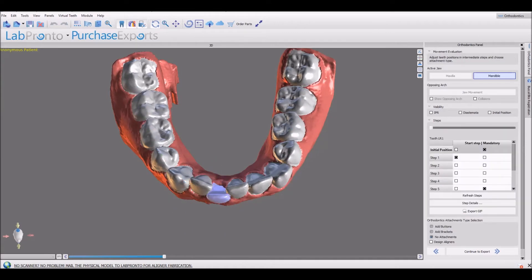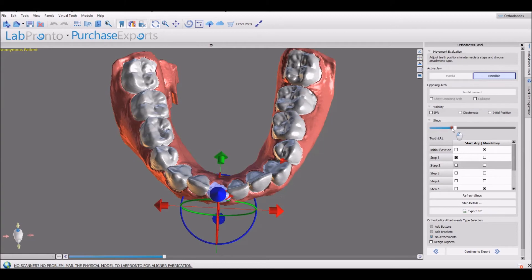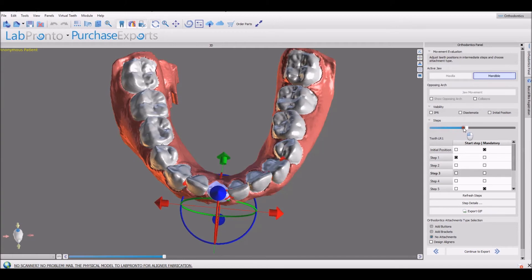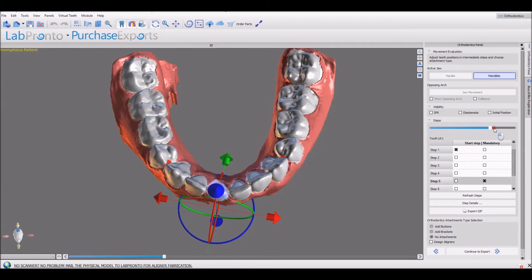We have added an export GIF button to the ortho module to allow the export of a GIF showing the teeth move from model to model, stage to stage, as we are seeing now on the screen.